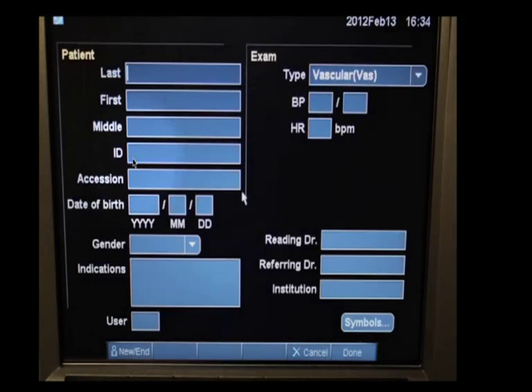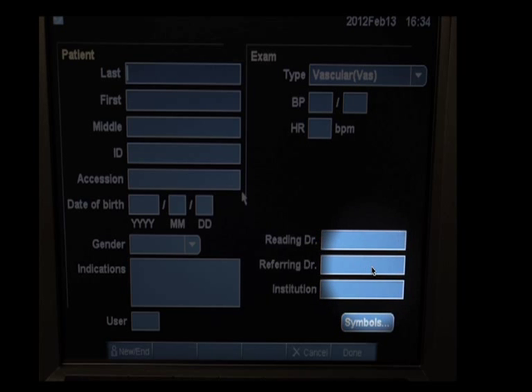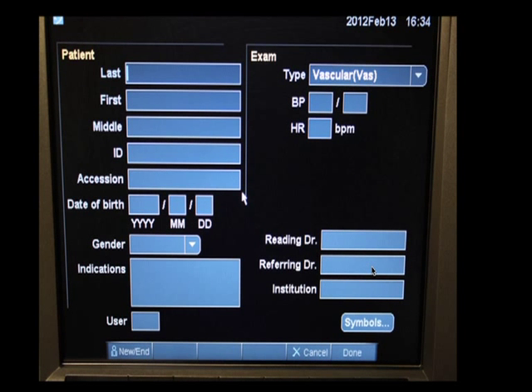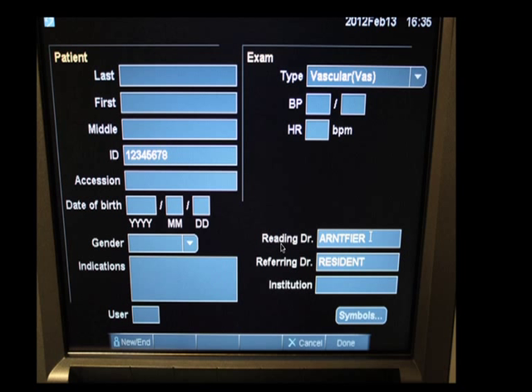You can press TAB to navigate down to the ID field or use the trackpad. Then your name — the scanner — goes in the referring doctor field. It's not your actual name but your Cerner login, typically your last name or the first seven letters of your last name followed by your first initial. That goes in the referring doctor field, not the reading doctor field. Think of it as: you refer this patient for a point-of-care ultrasound, and then honor the referral by doing the scan yourself. If you're being supervised by an attending physician, put their name in the reading doctor field and your name in the referring doctor field.